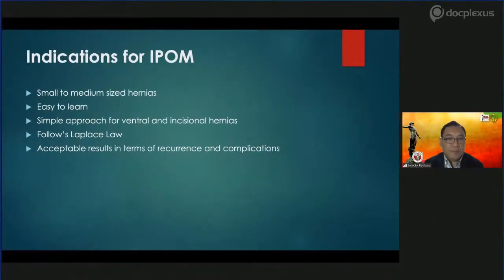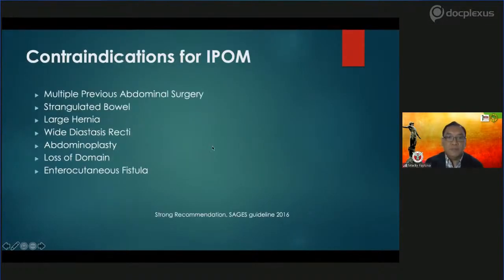Indications for IPOM, as I mentioned, small to medium-sized hernias. The good thing with IPOM, it's not so difficult to learn. It's a very simple approach for ventral incisional hernias. Of course, it follows the Laplace law and has a good result in terms of recurrence and complications.